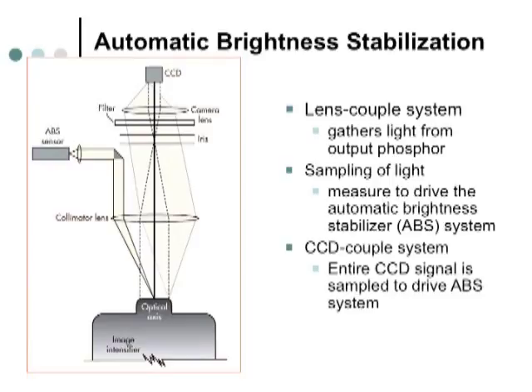So if you're x-raying a patient that's really thick, less light will come out. It will automatically put more radiation through the patient. A patient that's thinner, the amount of light coming out would be greater, and it will decrease the exposure. So it automatically adjusts the tube current to the thickness and the amount of light being produced by the image intensifier. What advantage is that? You always have a consistent image on your monitor that you're seeing, regardless of the thickness or thinness.